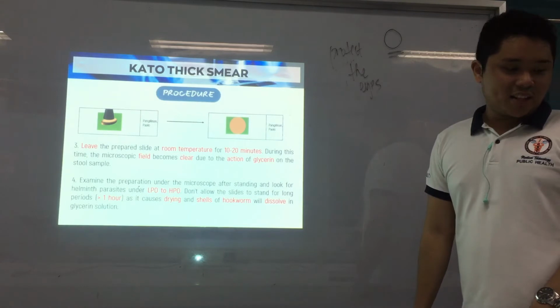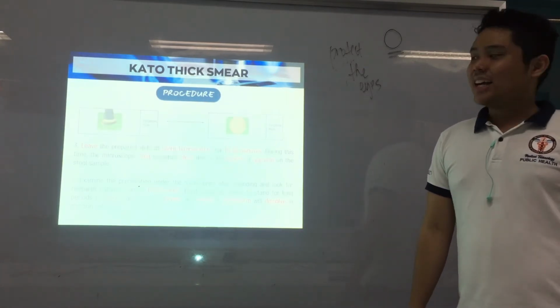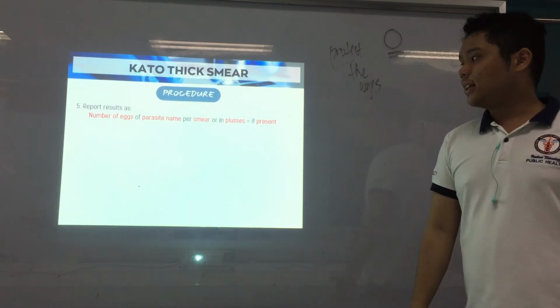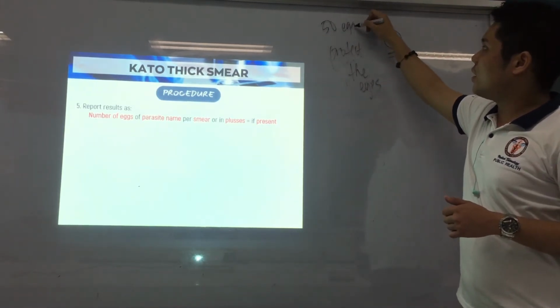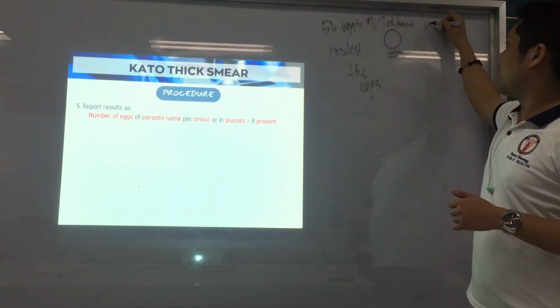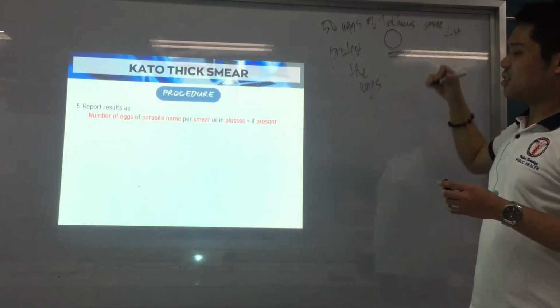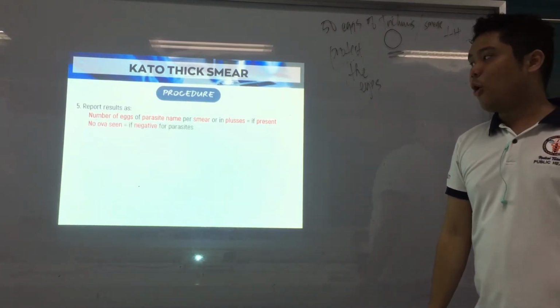Okay? Alright, so that's for Cellophane Smear. I hope na gets lang. Alright, ayan. So, again, report the results as we count the number of eggs pa rin using our counter. Alright? Or per smear. So, example, 50 eggs of trichuris per smear. Okay? Don't forget the per smear. Alright, ayan. Or in pluses, meaning if it's too much, like plus. Okay? Alright, but usually we count lang. Alright, if present. And if negative, no ova seen.